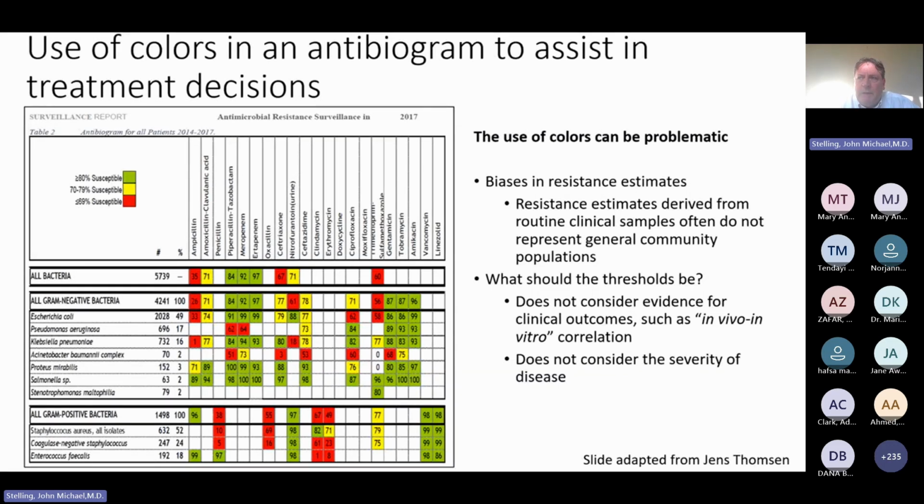And if you have susceptibility less than 95% where there's meningitis, you might want to do two things. You might want to do a more random survey to try to get a more accurate answer. Or you might want to switch to a different first-line agent. So susceptibility is less than 95% in a life and death situation. And if this is an unbiased sample, then you might want to switch to a different first-line agent.